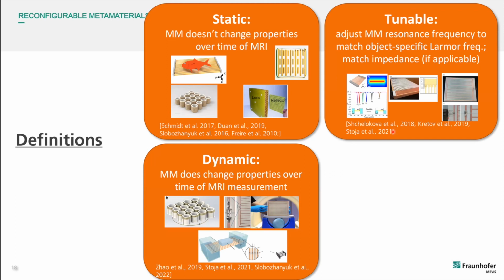And if you can adjust the resonance frequency of this metamaterial to match whatever frequency you want, for example, your Larmor frequency, it would be called tunable. So not all metamaterials are tunable.